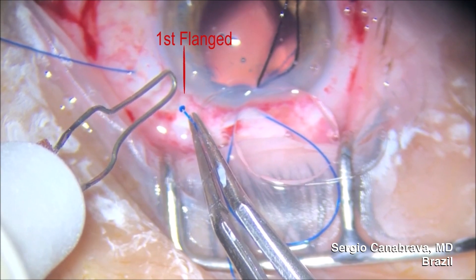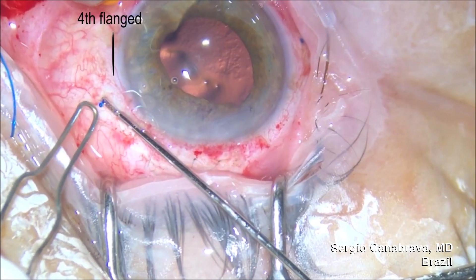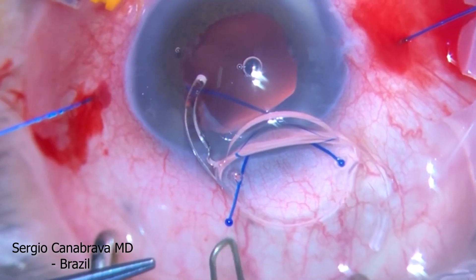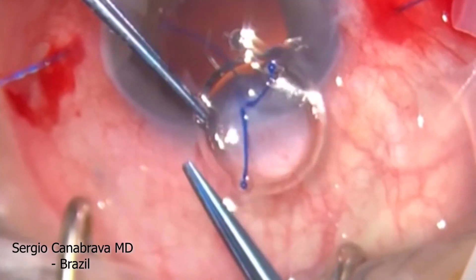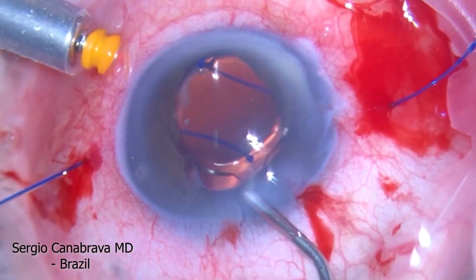On Chapter 1, we showed you how the four-flange technique works with an unfoldable IOL, based on Dr. Aubram's and Dr. Yamani's technique. On Chapter 2, after presenting the IOL punch, we went over how to apply the four-flange technique with a foldable IOL.